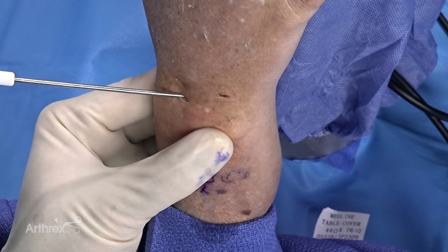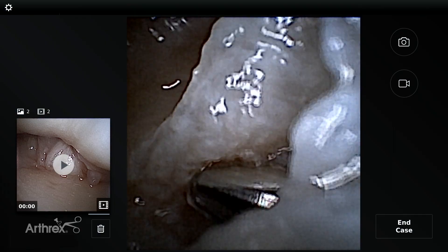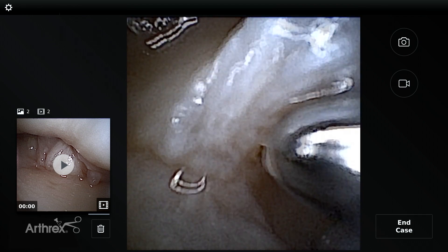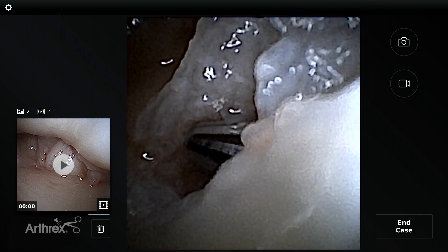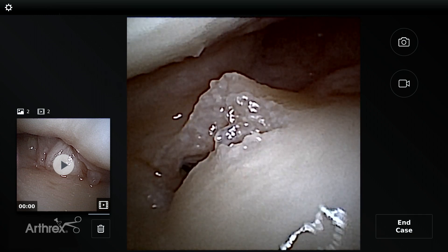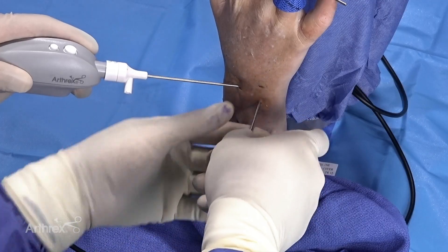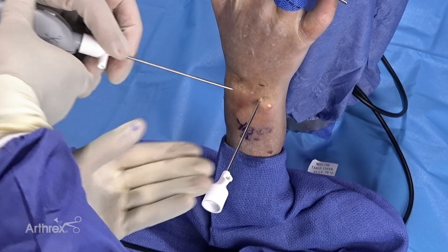Now I've introduced the nanoscope trocar and cannula system. You can see it's blunt, and now I'm underneath the TFCC — this will allow us to get into the DRUJ. I know I'm in the right place at the right time. There's minimal fuss and no guesswork; all the guesswork has been taken out by looking at our portal of entry using the nanoscope. Now I take the nanoscope out of the radiocarpal joint and I know I'm into the DRUJ.